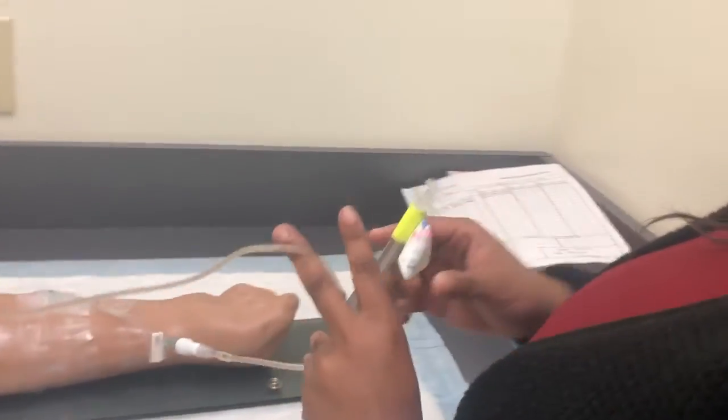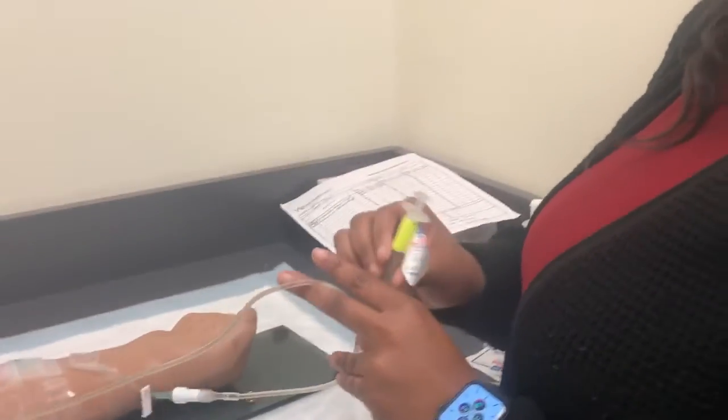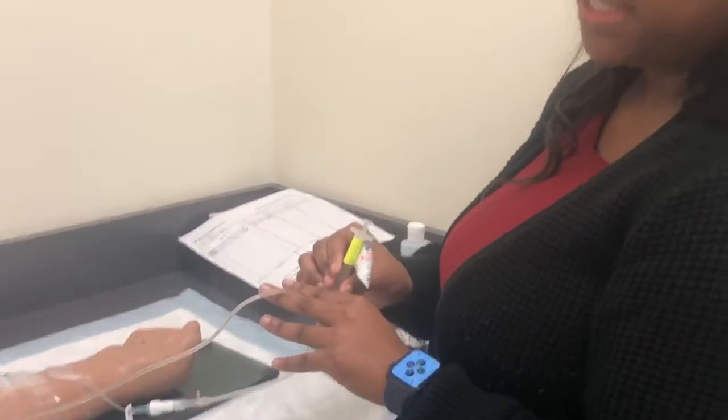Okay, I release my primary fluid, constantly making sure that my patient is fine and tolerating. At this time, letting my primary fluids flow through for 30 seconds.